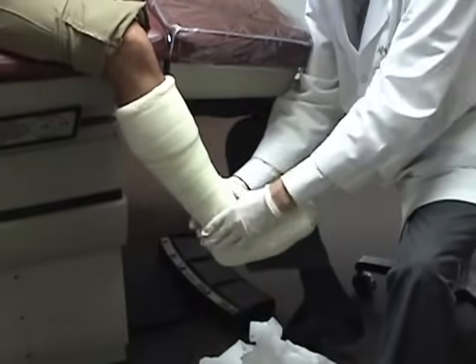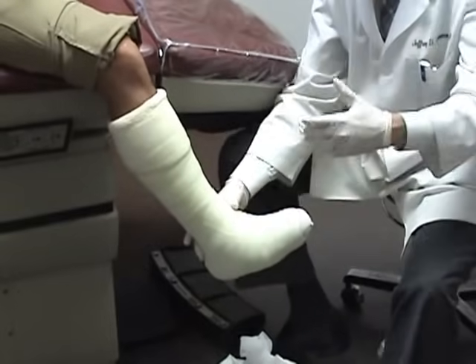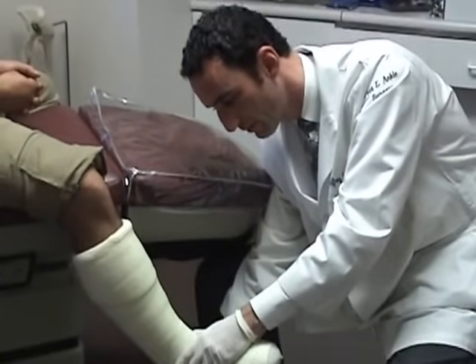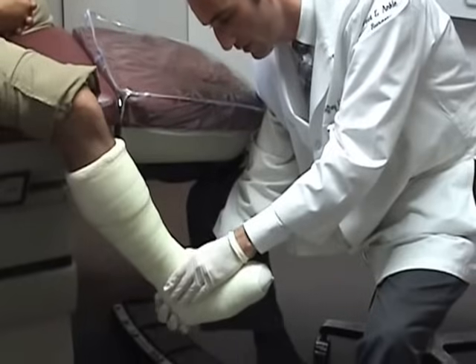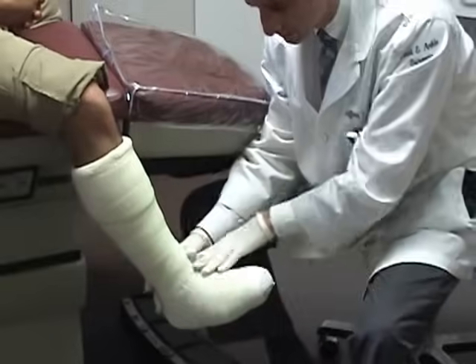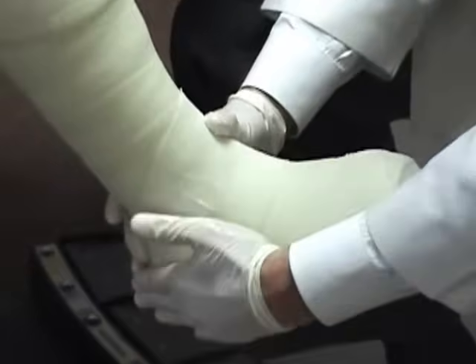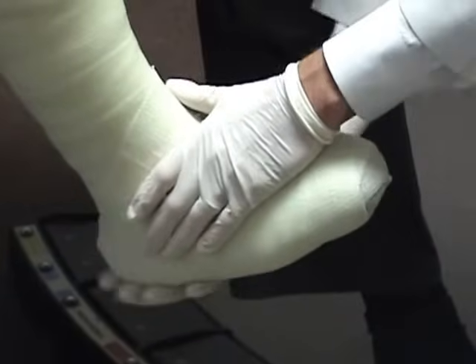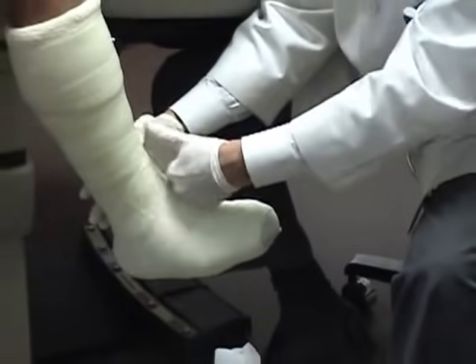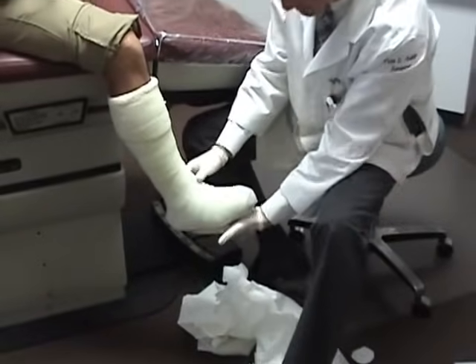Before it's totally dry, just to enhance the concept of total contact, try to identify any areas where there might be any space. One of those is the Achilles tendon area — sometimes you can feel there's space there. You can squeeze on either side of the Achilles tendon. Sometimes right under the malleoli requires some forming, and the same on the other side. The patient is now to sit here for about 10 to 15 minutes before they're able to step down on it.